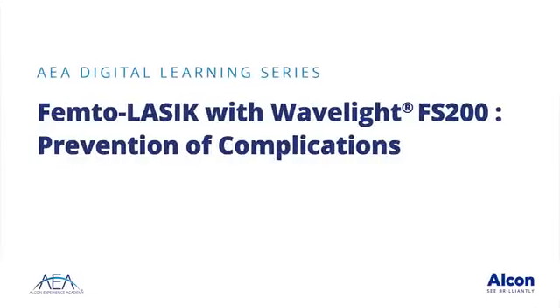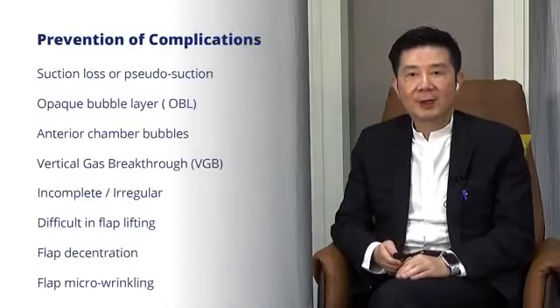This talk is about prevention of complications in femtosecond laser with FS200, following the previous module on standard operating procedure. The following complications will be covered.